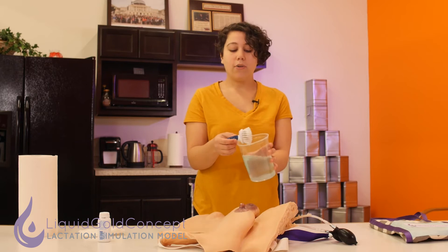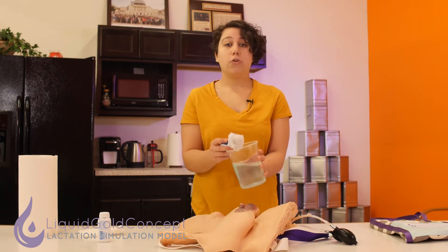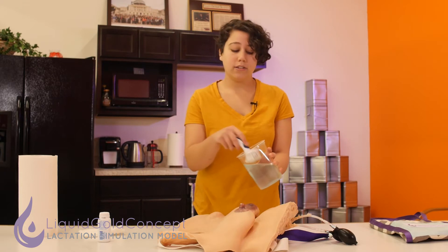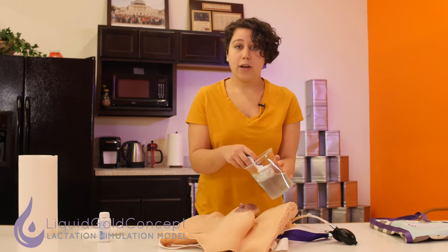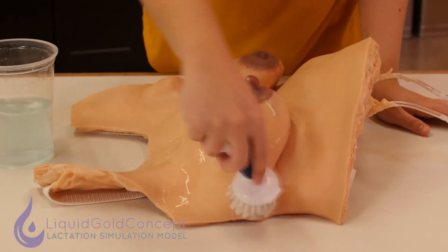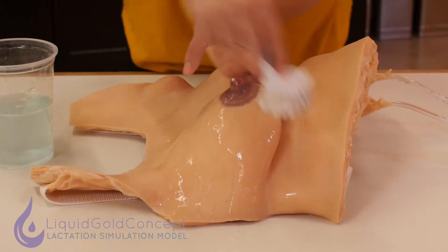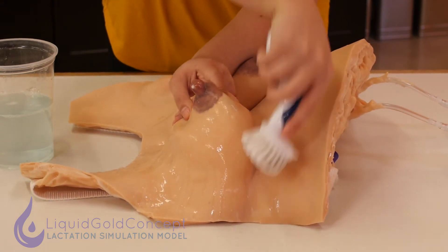I've gone ahead and just filled this up with water and a few drops of dish soap. I also have a soft bristled cleaning brush. If you don't have one, that's totally fine — you can just use your hands. The way I like to go about doing this is just get some water on the LSM and scrub all of the topical surfaces. Make sure to get underneath the breast because under there some grease and dust tends to accumulate.